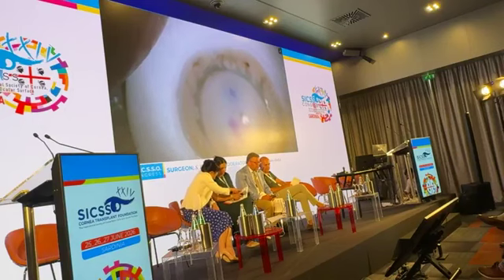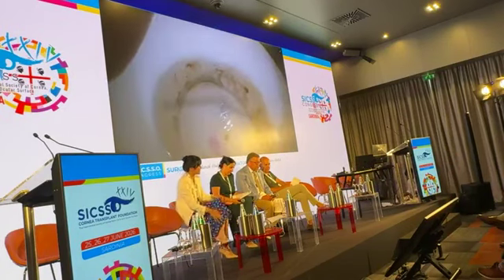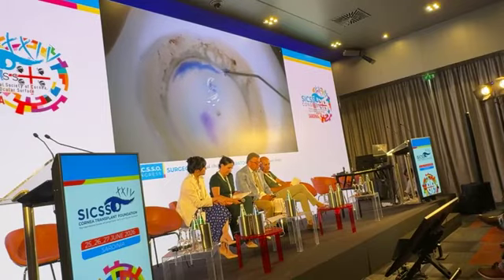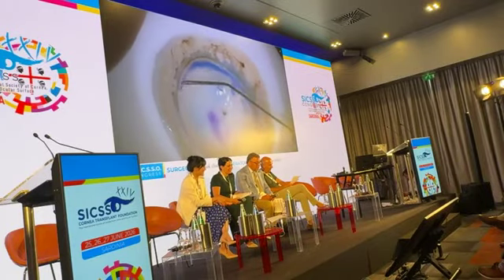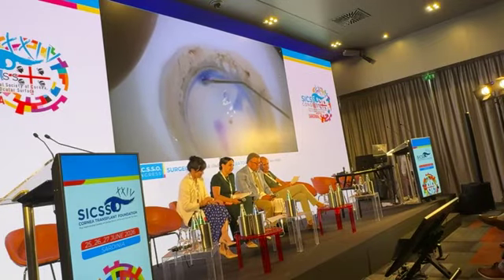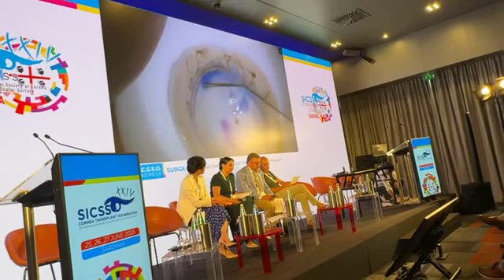So you need to check. So 8 millimeter. Give me an 8 millimeter punch. Okay, so now we have checked the position of the hinge because the tissue was pre-stripped. Now that it has been identified, he has decided the size of the DMEK, so the donor tissue will be punched at an 8 millimeter size. So we are now opening the punch for preparing the instrument.